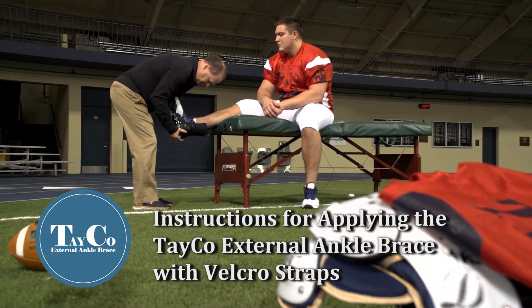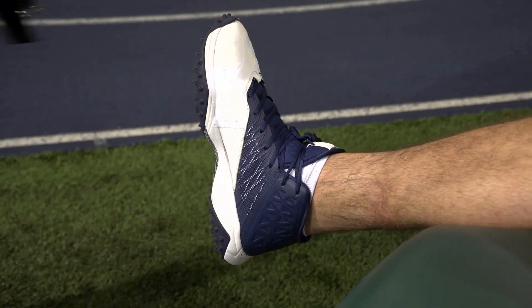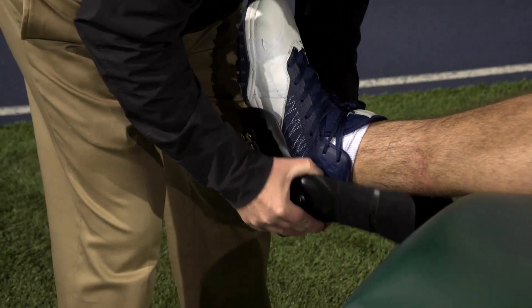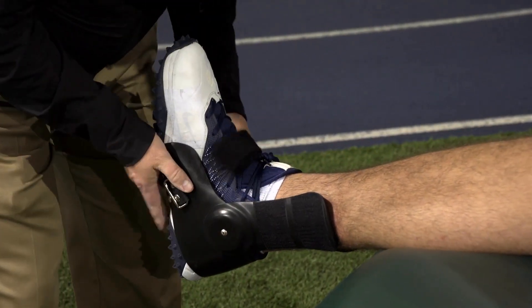Instructions for applying the TayCo external ankle brace with Velcro straps. Step 1: Apply the brace from back to front, securing the heel portion first. Then position the side walls around the mid-foot region.